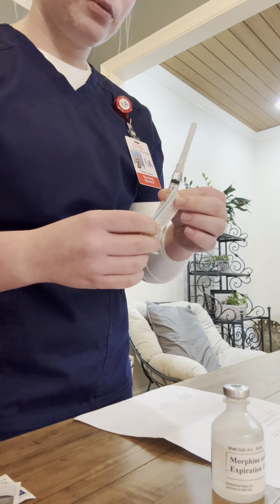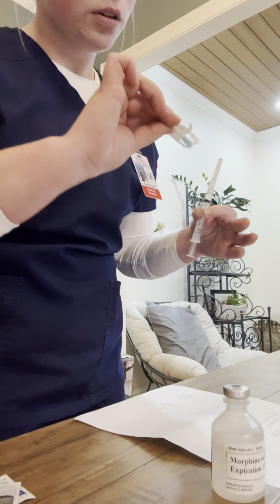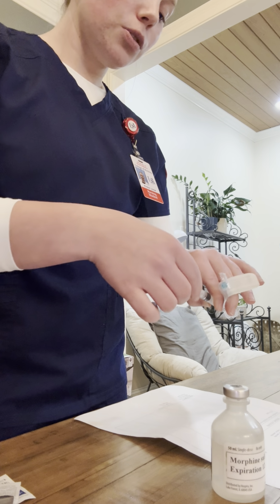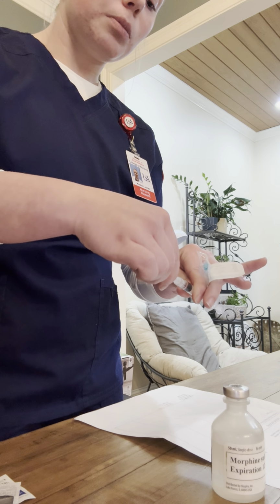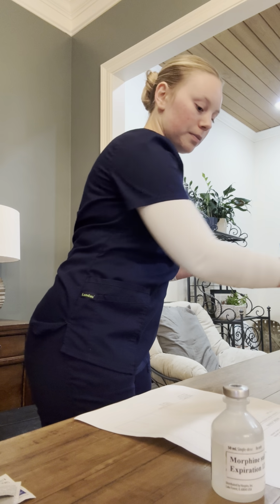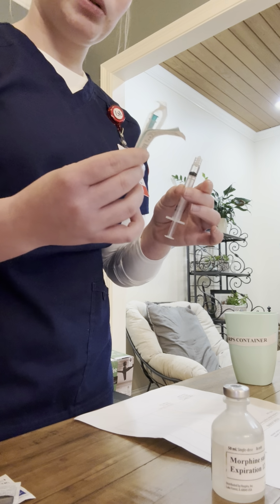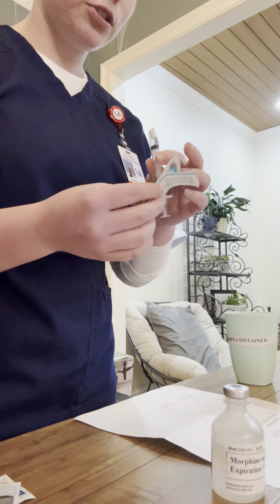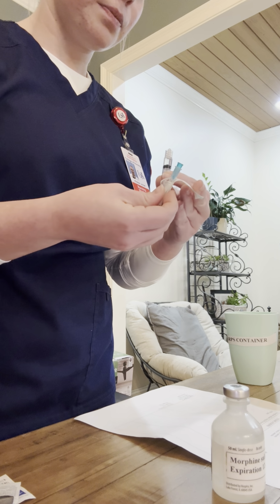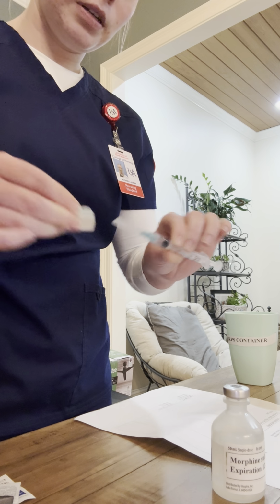So I will be using this 23 gauge needle. Yes, that's right. So I'm going to remove the blunt cannula and place this in my sharps container. And then I'm going to apply my needle to my syringe. Twist it on, throw this away.